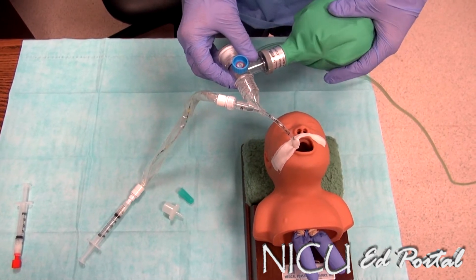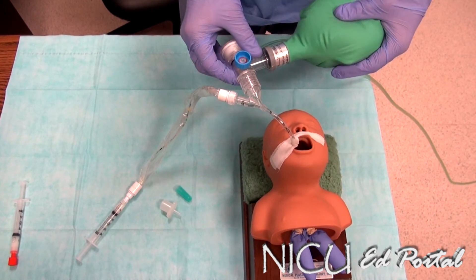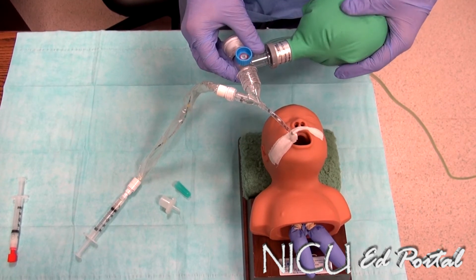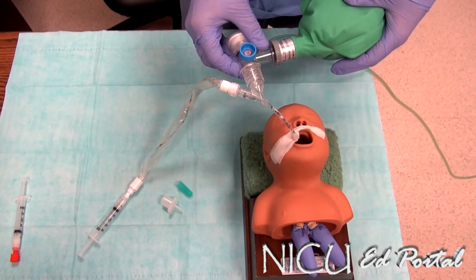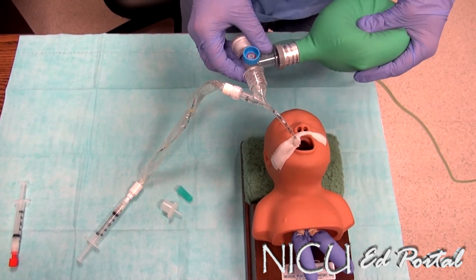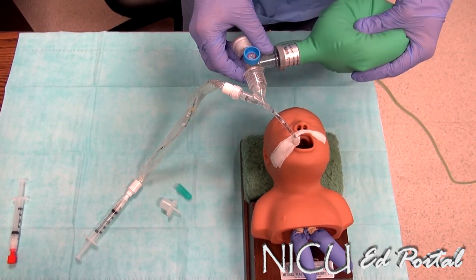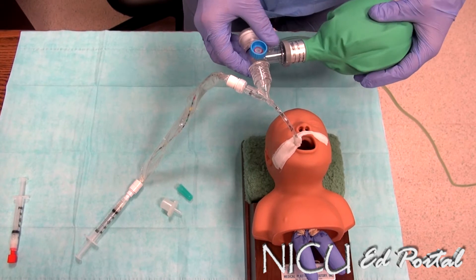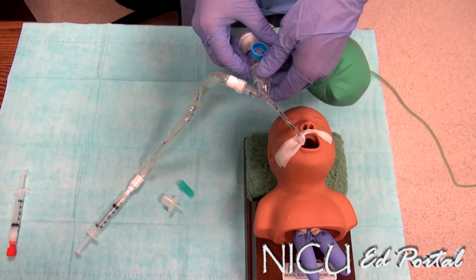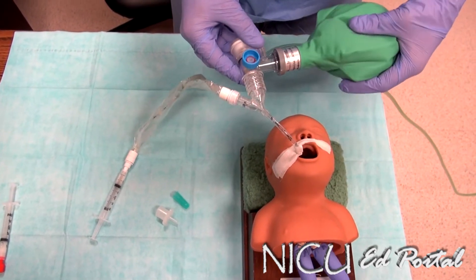The next step is inserting the catheter to proper placement, administering the surfactant, and removing the catheter, making sure our patient is stable through the process. We need to properly measure the correct depth of the catheter in the ET tube and then administer the surfactant. For the purpose of the video, I will focus on inserting the catheter, and we can continue manually ventilating the baby through the whole procedure.